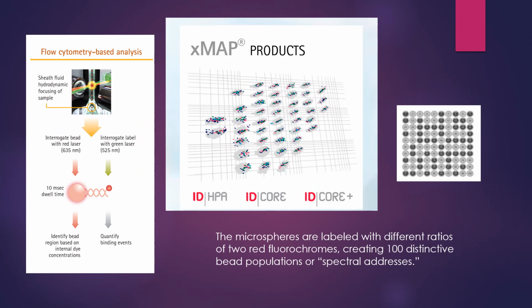So how the Luminex works in general, all the assays are bead-based. The beads have a mix of red fluorescence. So you can imagine a map, and based on the fluorescence of the red, it's going to land into one of these buckets. So for example, this bucket may be for JKA, this bucket may be for JKB, and you want to have beads in each bucket, because if you don't have any beads, then there's something wrong with your assay. You lost the beads somewhere in the process.